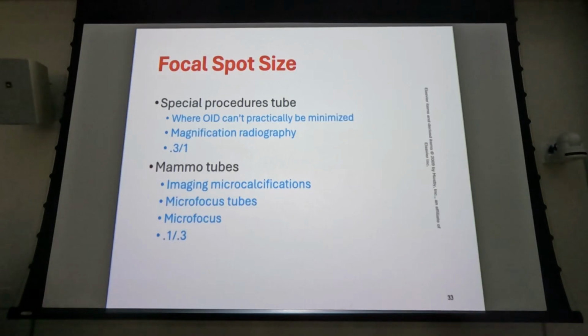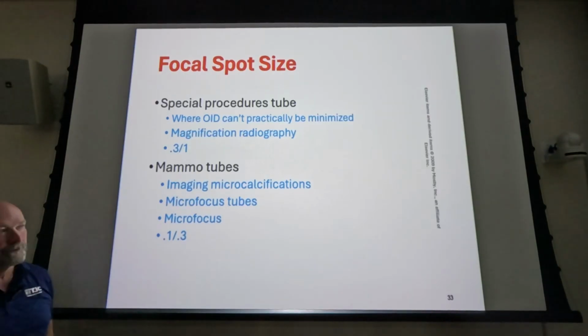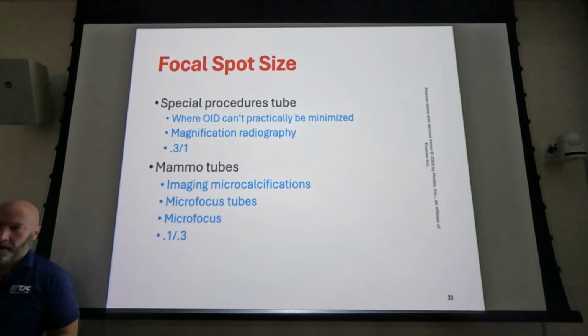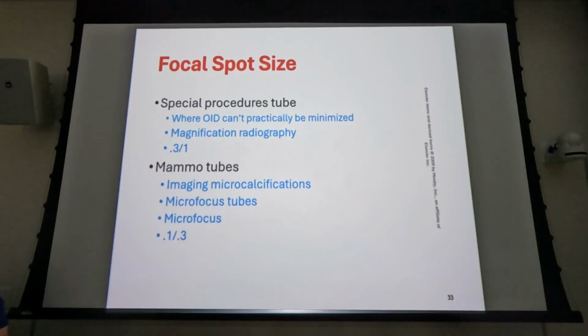We do have some special X-ray tubes. We have modalities where we need to bring out sharpness or recorded detail more frequently, and it's more important to see that sharpness or recorded detail than in the diagnostic room. So special procedures routinely utilize increased OIDs.